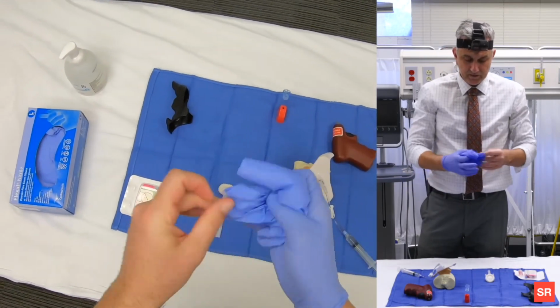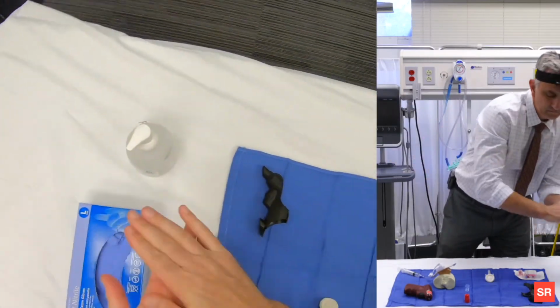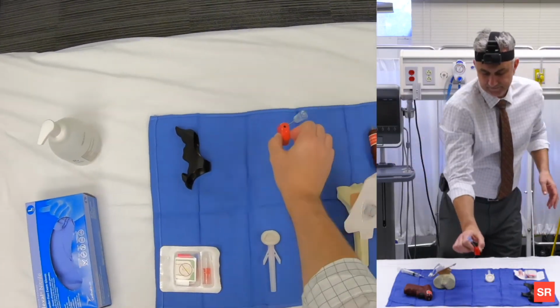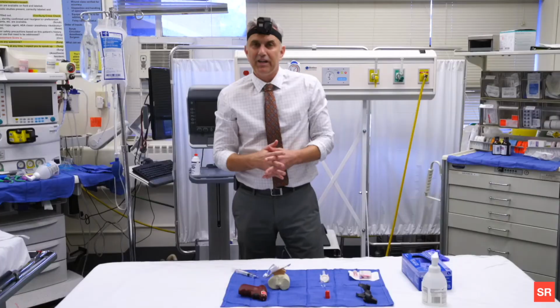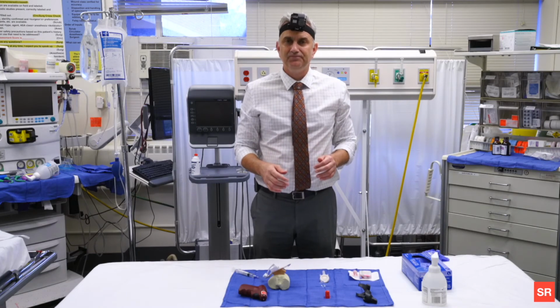I'm going to remove my gloves, wash my hands, and dispose of sharps. And that's how you place an intraosseous line on a pediatric patient in the tibial location.